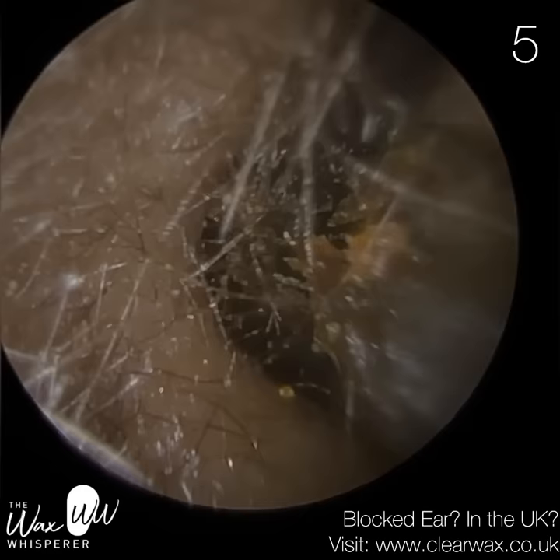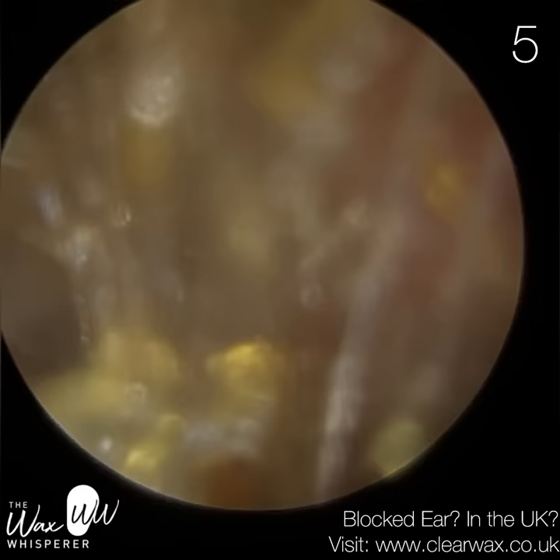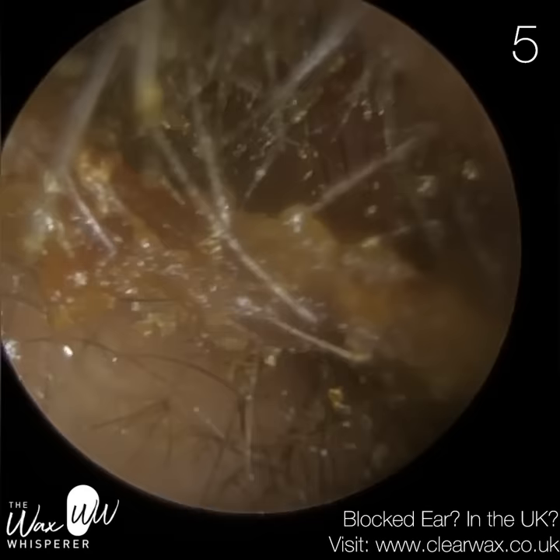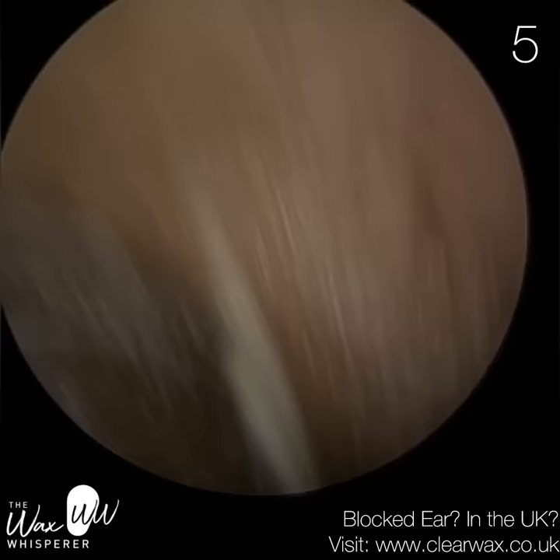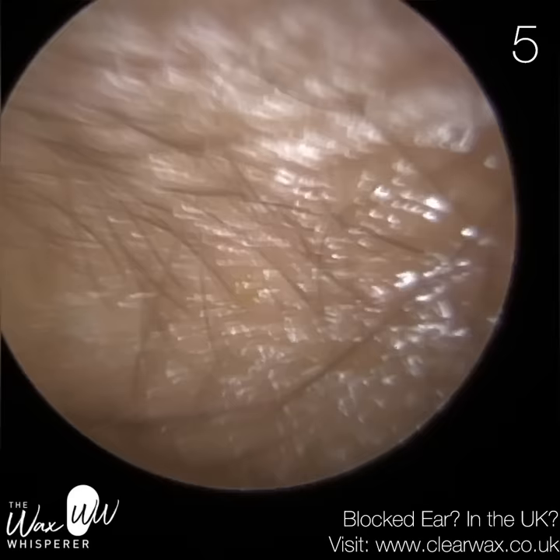I've just managed to get the hook in there — there's a little gap. With suction it was just too embedded and wasn't really moving much. There's a big lump there. We're just going to mop all this up. The eardrum is now visible but there's a bit of wax in the way. Someone says these hairs are almost like a spider's web — they've captured some of the wax as I was removing it. Is there a need to remove these hairs? No — the hairs really don't cause a problem unless you can't see anything. On a couple of instances I've had to use forceps to pluck the hairs away because I just couldn't see, but otherwise they're best left well alone.